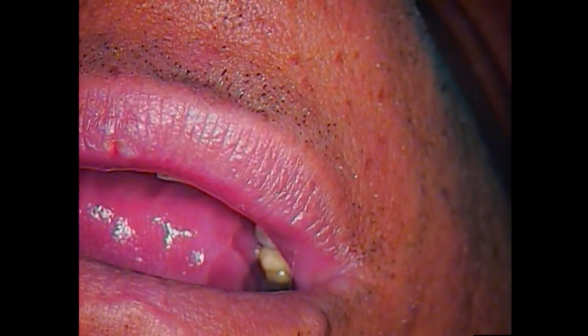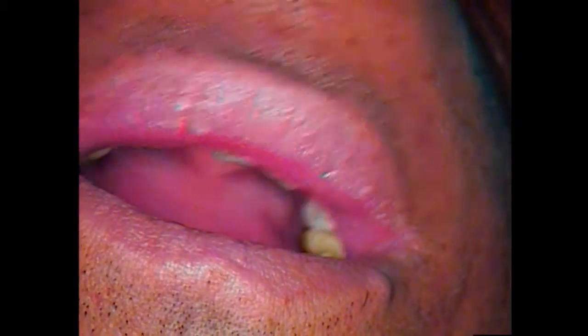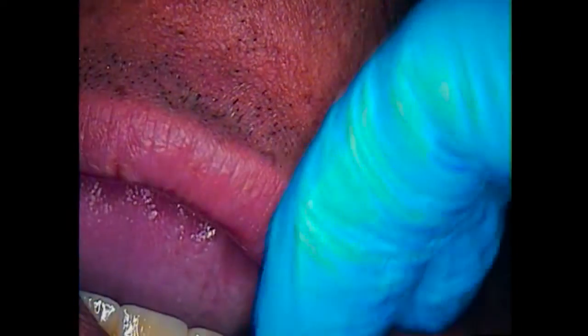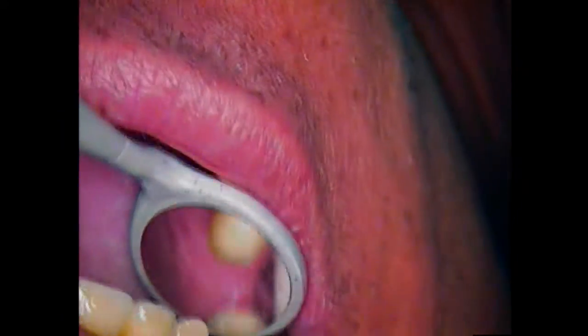Now in the mouth — by the way, Florence and Brent from 3i are terrific people. They've given me the preliminary instruction of what to do. There's a strict protocol by the company and we will follow that to the T. The patient is aware now that the tissue has actually grown over the fixture of the implant body in the mouth.